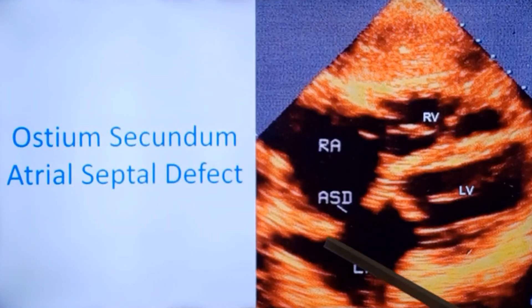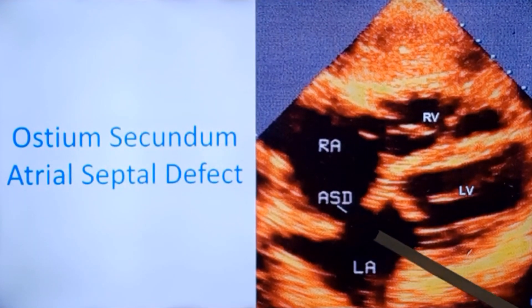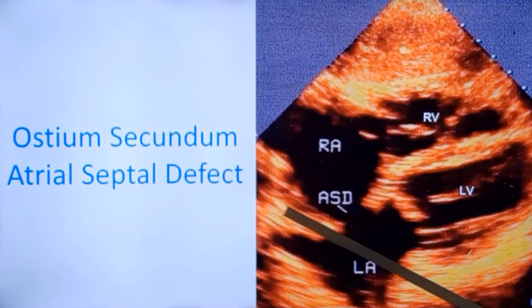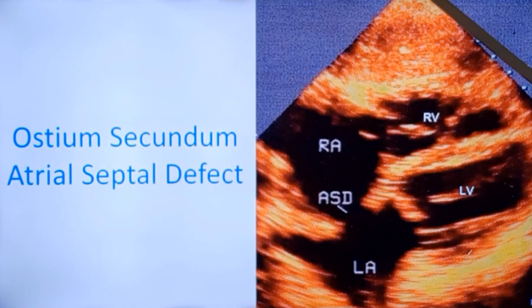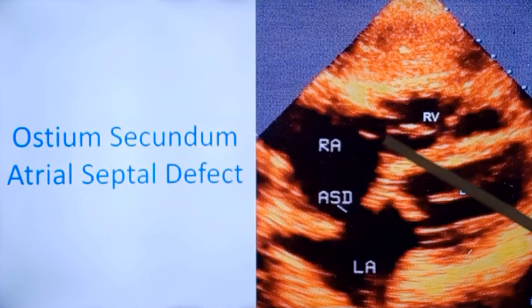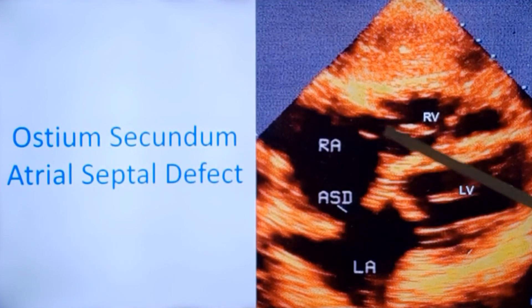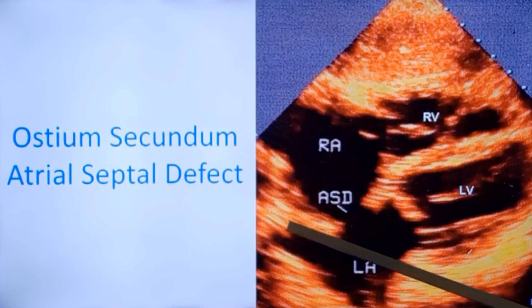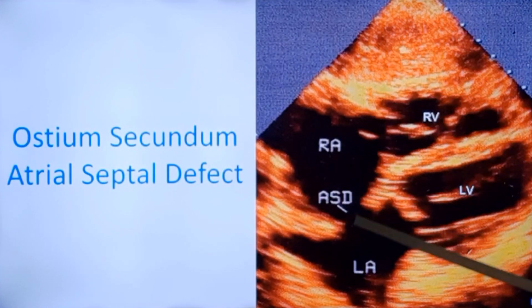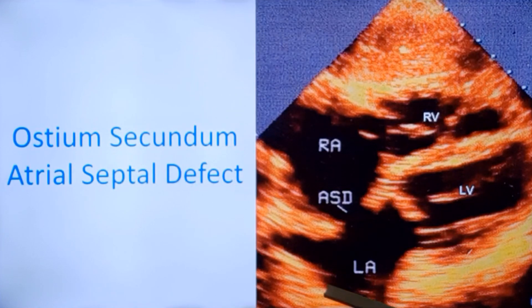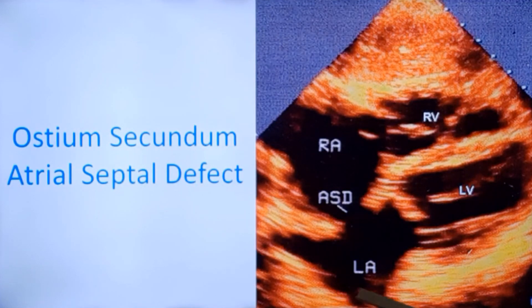This is an echocardiogram in ostium secundum ASD. You can see that the defect is in the middle of the inter-atrial septum. This is the subcostal view, which images the inter-atrial septum best because the septum is perpendicular to the image plane — that is, the transducer is sending a beam like this and the septum is almost perpendicular. That is the best way to image a structure in two-dimensional echocardiography.